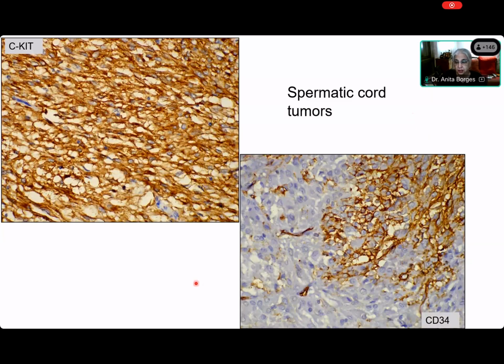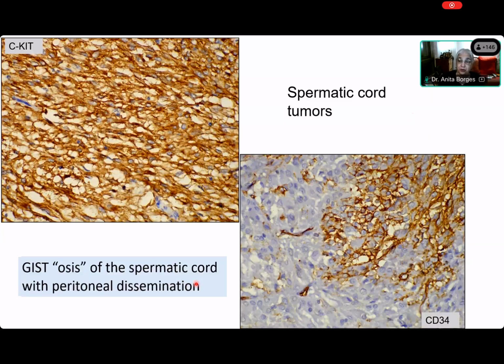So what is this case now? Instead of leiomyomatosis, this is a GISTosis. In other words, it's a gastrointestinal stromal tumor of the spermatic cord with peritoneal dissemination. And I think that this was a tragedy. Of course, the patient is still alive because he is on Gleevec. But this should not have happened. If we had done the 34 on that tumor the first time, because it was very SMA positive, somebody thought, what else can it be? It's a leiomyomatosis. So what are the lessons that we have learned?